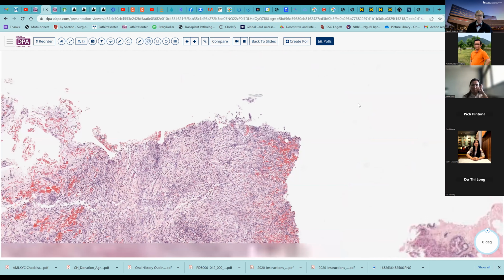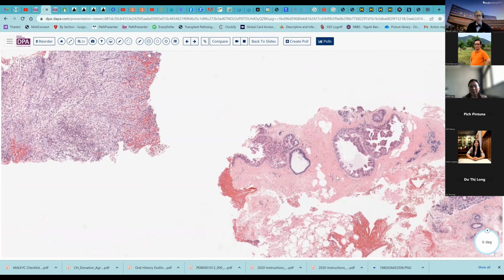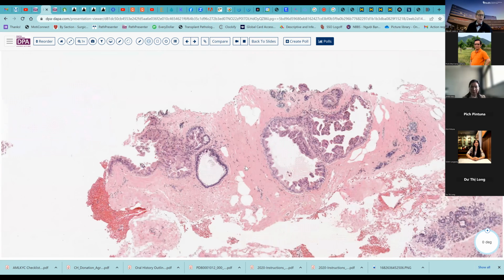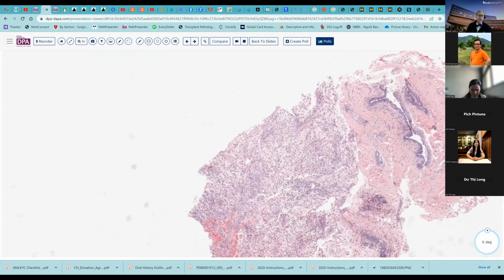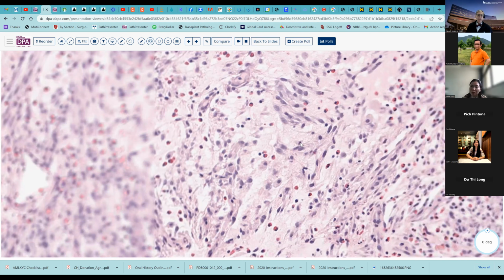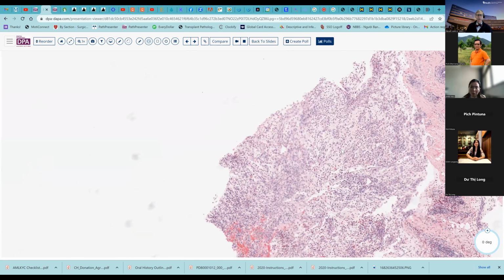Sorry about that. Here we're probably, well, let's see, are we in the breast? Yes, it looks like we're here in the breast. There's some nice breast tissue. And so this is a lesion within the breast tissue. And you can see that it's got a few of these sort of myofibroblast type cells, a lot of eosinophilic cells associated with this, as well as the other inflammatory cells.